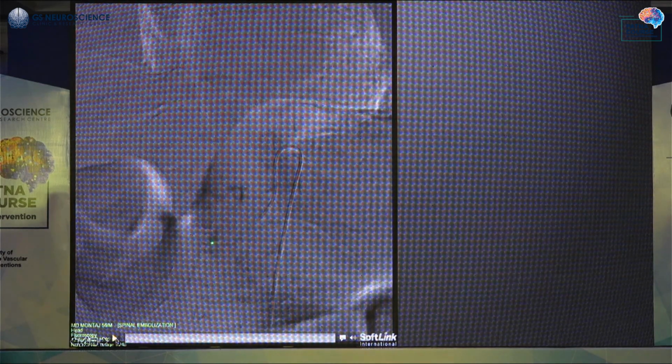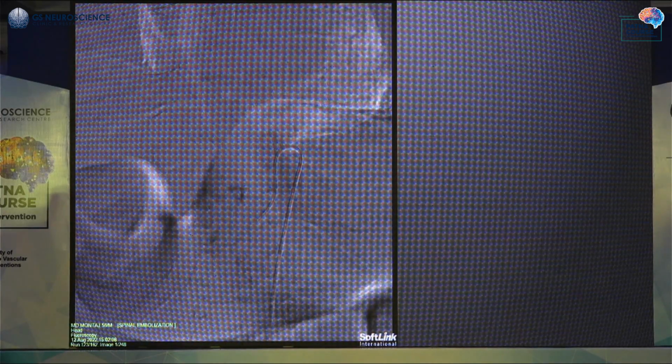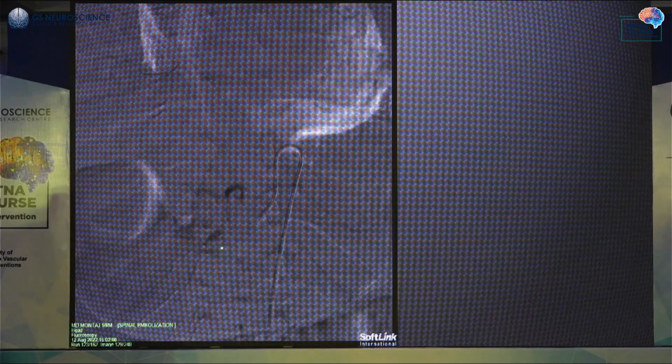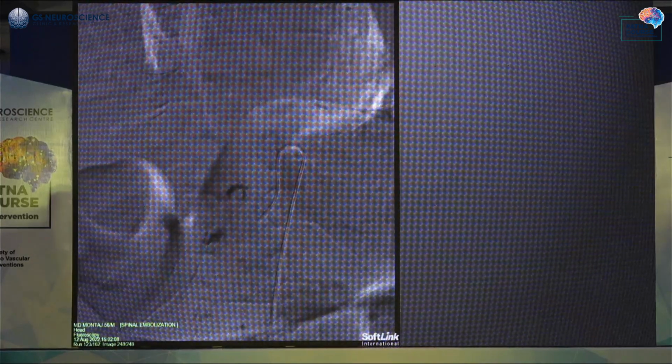I mean, actually, the initial glue went into the vein, and then there was a gap, and it started filling here. I leave a little gap, pause for a minute, because I've already got the vein, and then inject further again. As you can see here, I'm filling it again, depositing more, and then when a reflux comes, I pull back on the syringe and pull the whole thing out.